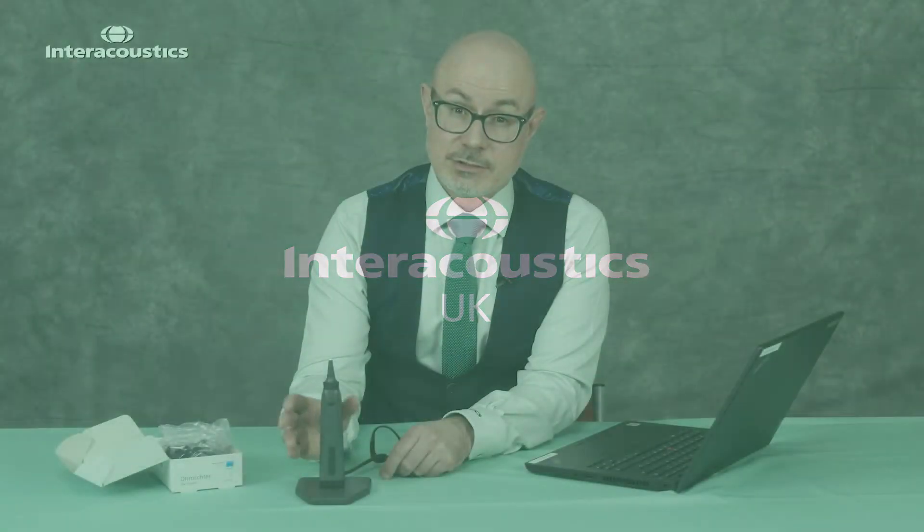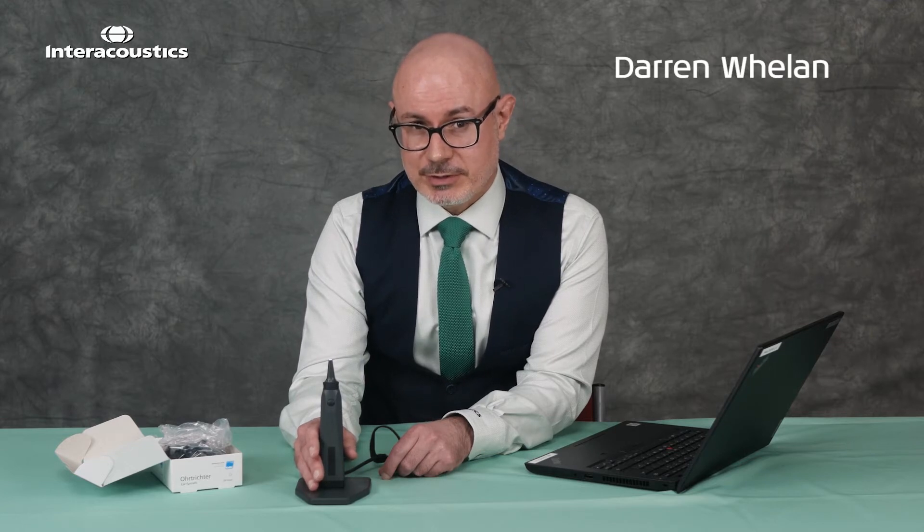In today's video we're going to look at the viat, our plug-and-play solution for otoscopy.